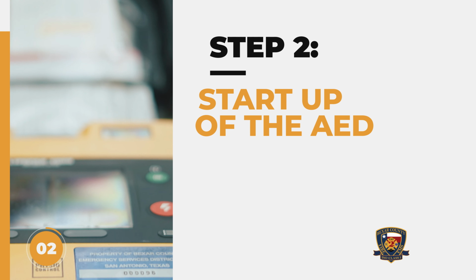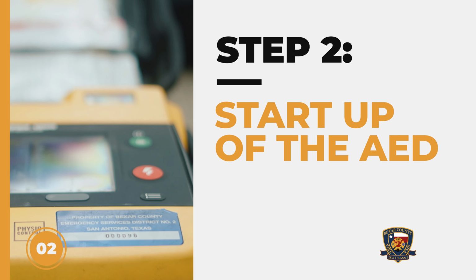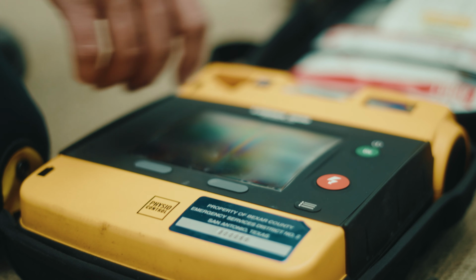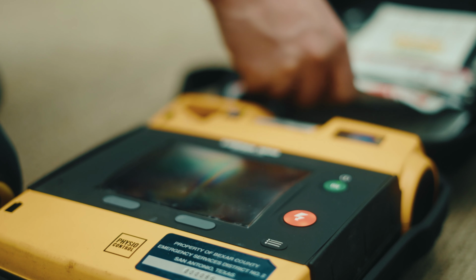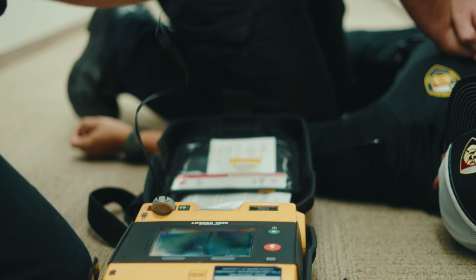Step 2. Startup of the AED. Ideally, somebody should be performing chest compressions while another person readies the AED for use. Most AEDs will power up once it is opened, and some may require depressing a power button to activate it. Please follow the voice or text prompts for your specific device.